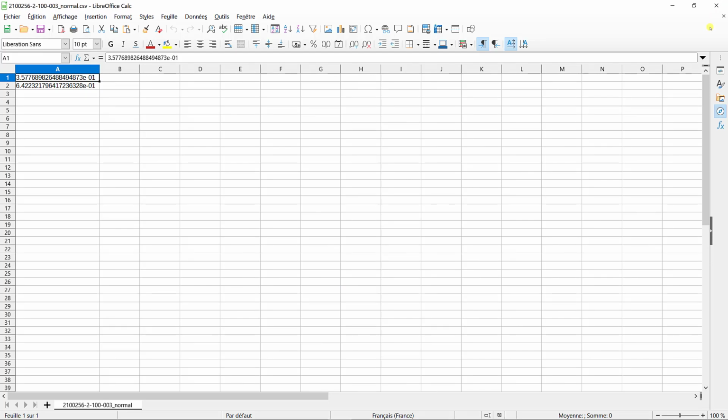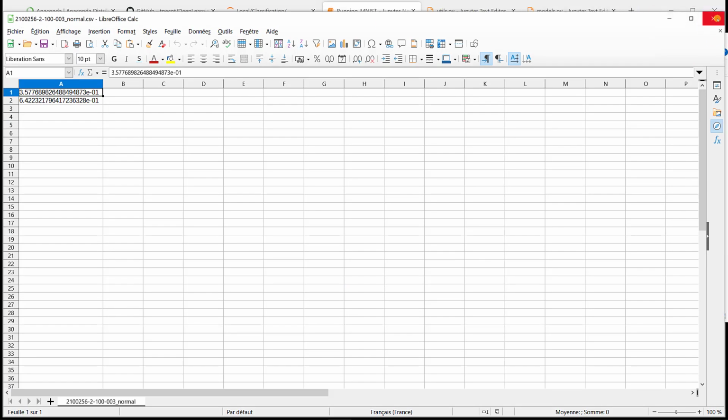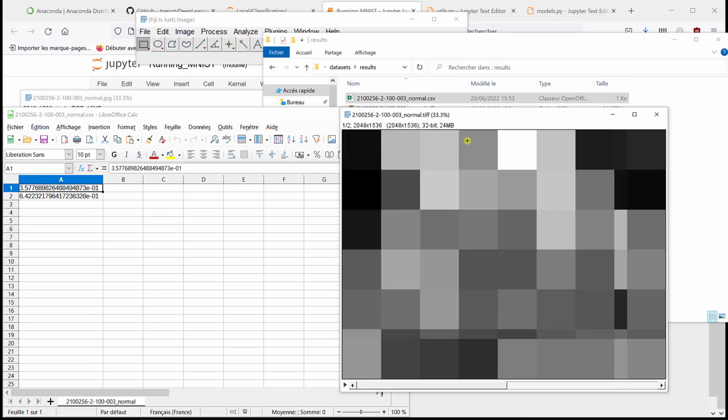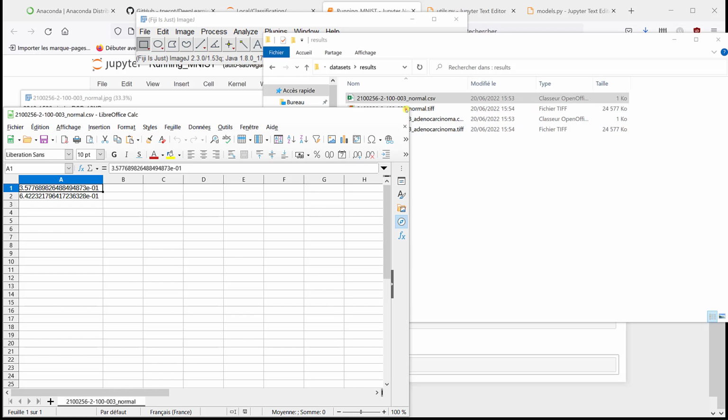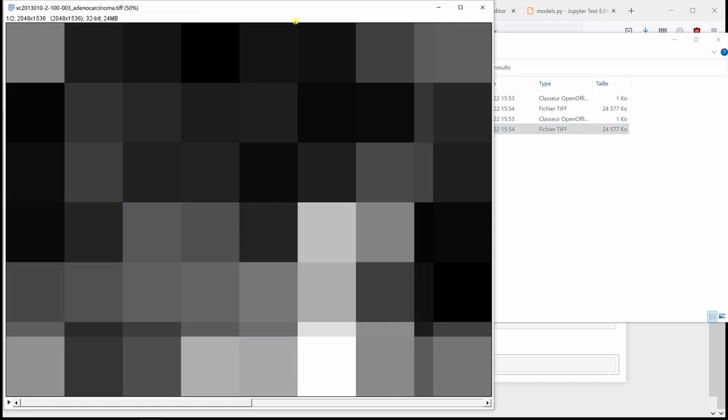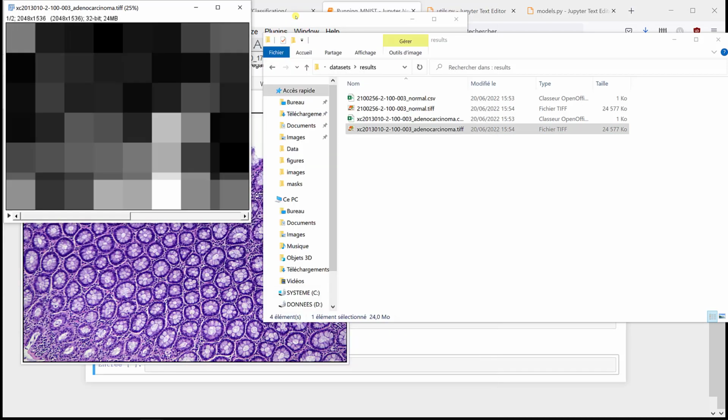Obviously it's weighted by the size of the image patches, because I can't have only 256 by 256 patches, so you have some that are smaller here. These ones may have a lower weight than the other ones. But basically, this corresponds to the average score for each of your classes. And so clearly for the normal image it didn't work. For the adenocarcinoma, overall it worked.